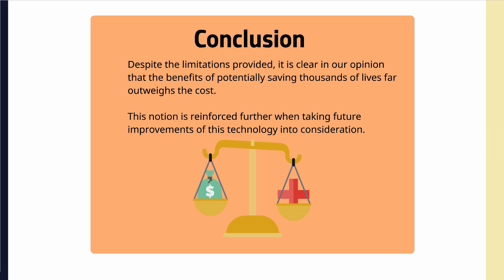may cause. Some future prospects for this technology would be more efficient ambulance-based CT imaging equipment, which would allow for the scans to take place faster. Generally, a CT scan takes approximately 5 minutes to perform. However, in the event of a stroke, every second is valuable, so reducing this time is absolutely vital.